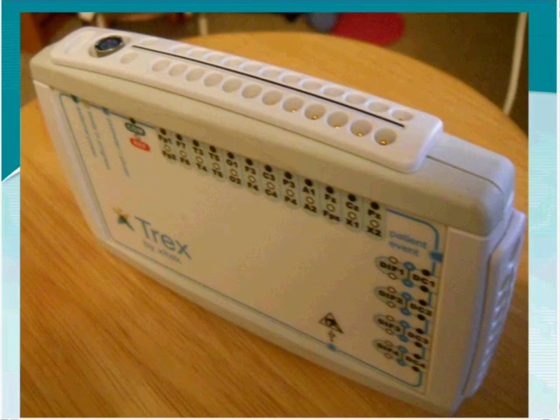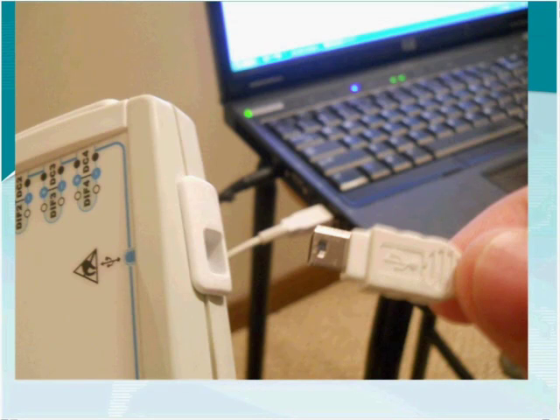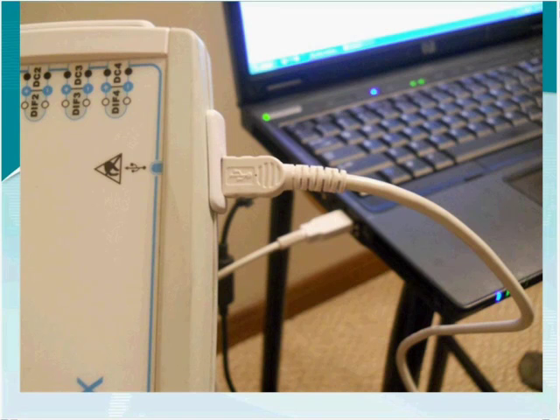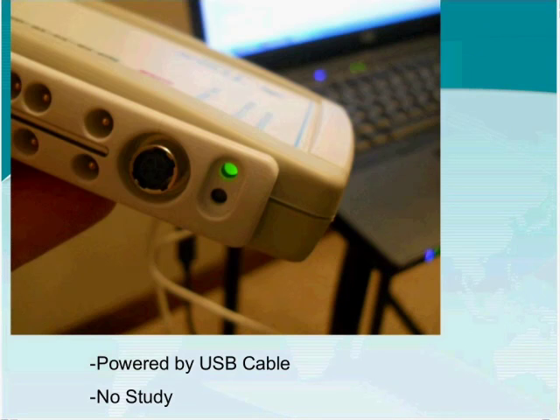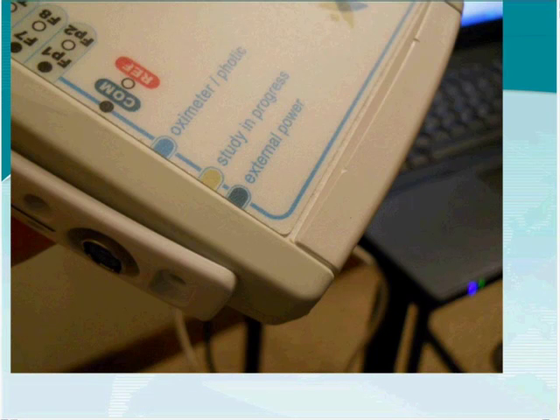The Trex is powered by one of two ways: either by batteries or by a direct USB cable connection. There is a mini USB cable that goes from your computer into the side of the Trex. Once connected, we know it is receiving power from an external power source. On the side of the unit, there is a label that says 'external power,' and a green light is on when the unit is being powered by the laptop or computer.